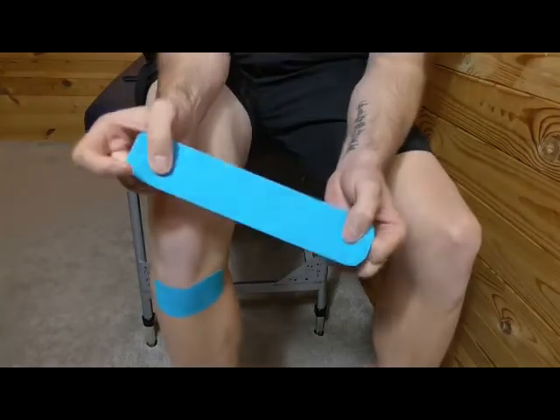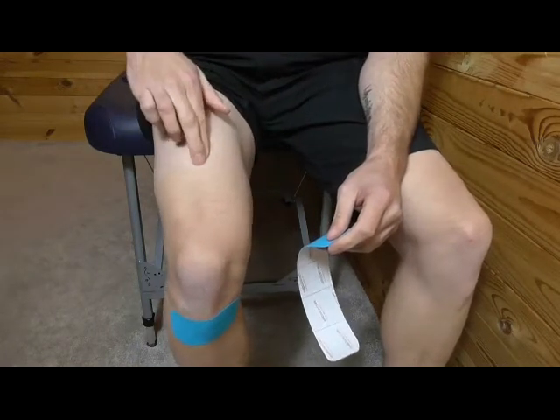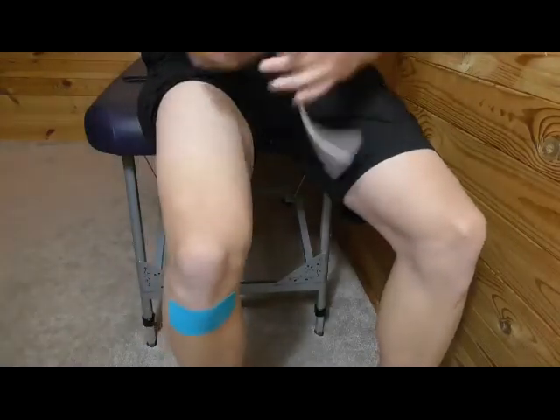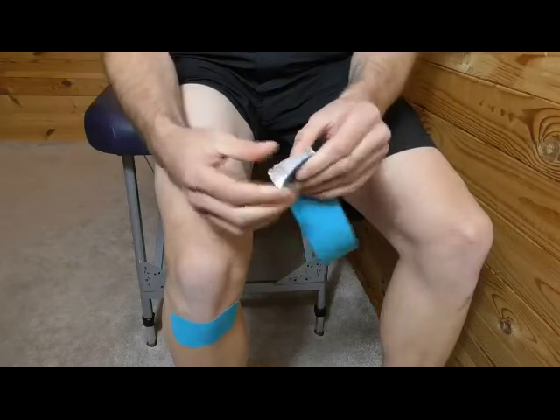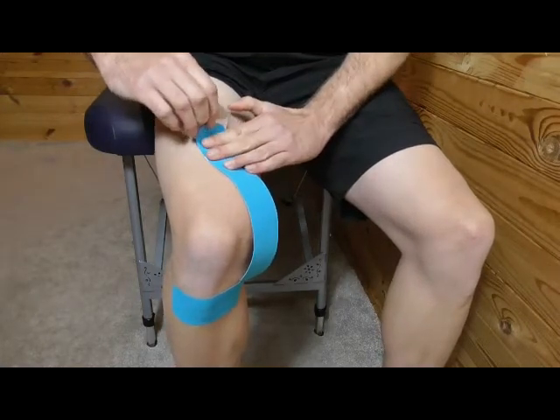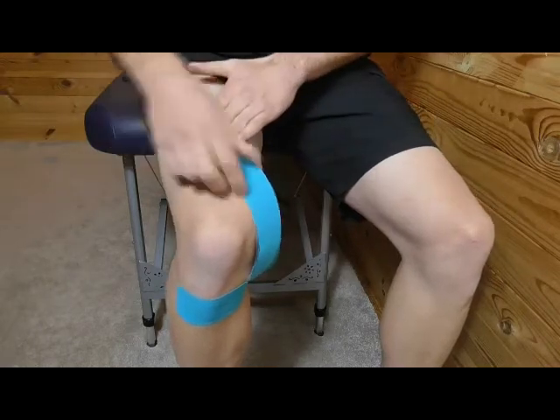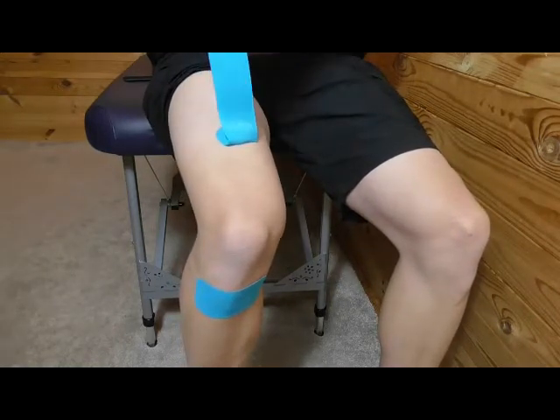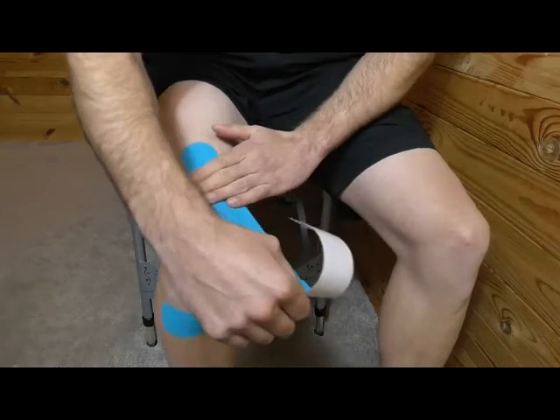Grab the second, longer eye strip. This one comes from roughly the middle of your quad — the front of your thigh — around the inside of your knee, and then it's placed on the tibial tuberosity again. Peel it back from the end, expose the end but don't touch the tape. Place it roughly in the center of the thigh with no stretch on the end. Pin the tape and pull it back to expose, then feed it all the way around the inside of the knee with about 25% stretch.